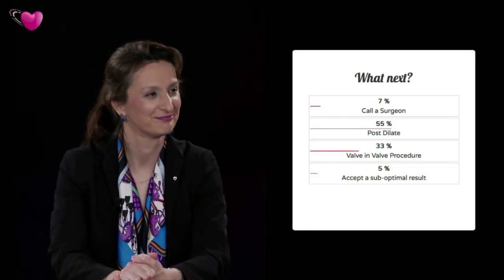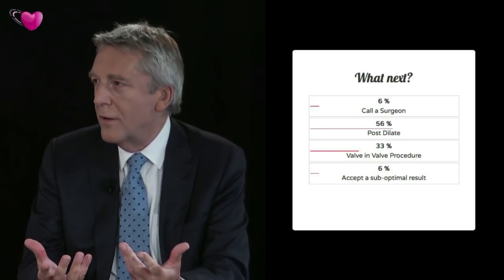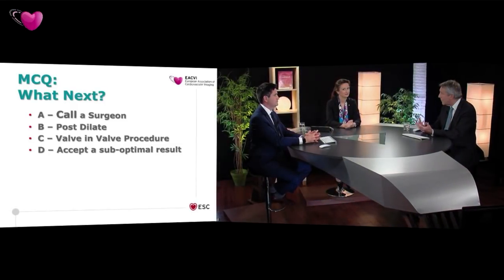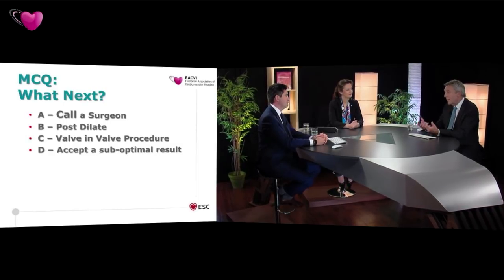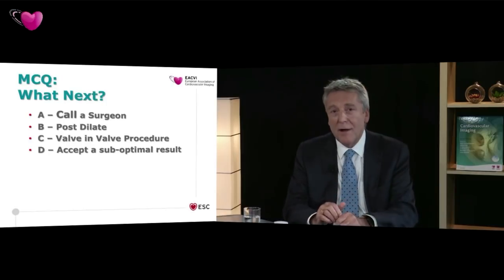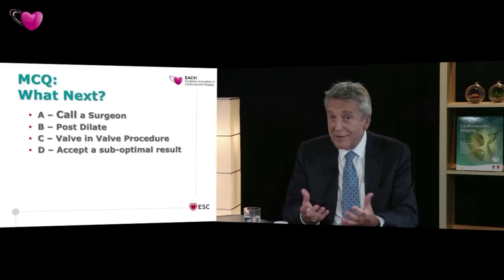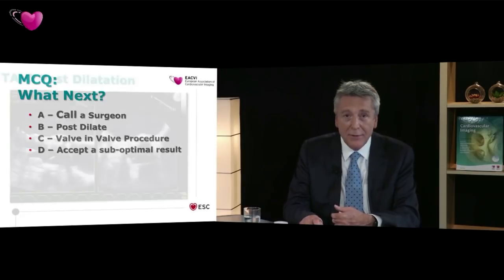Well, that's very interesting because, traditionally, you would think that a valve-in-valve wouldn't work that well for perivalvular regurgitation. It's good for transvalvular, but not for perivalvular regurgitation. But actually, we've used it quite successfully in many cases because the cuff around some of these valves, in particular the Sapien valve, is quite good at sealing off the area around the valve. But this patient, we'd already had a balloon rupture, so that may not have worked so well. But having said that, what we decided to do first of all was to post-dilate. So let me show you what happened.